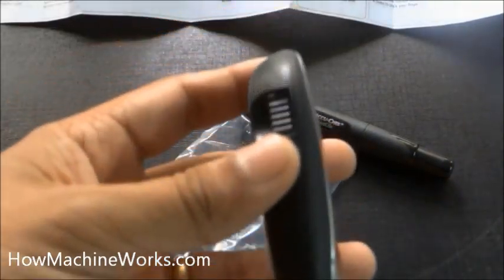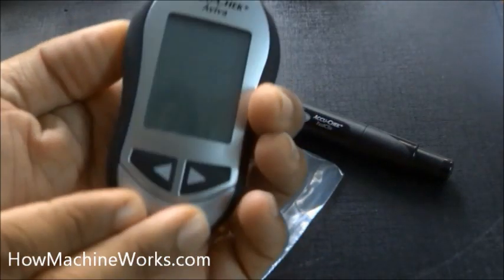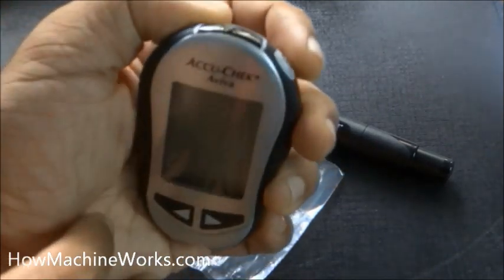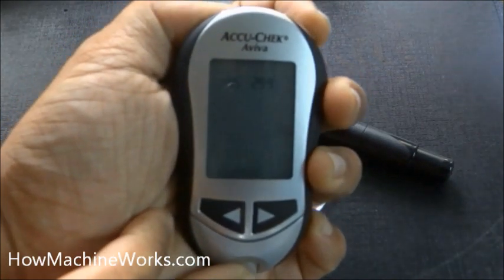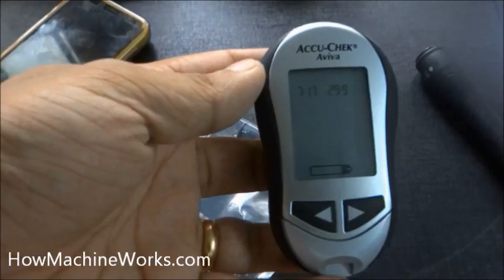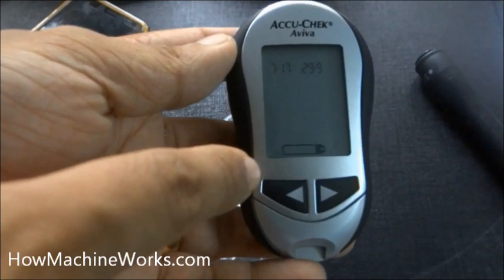Now that's the meter — the active check meter. The chip is already inserted. Now switch on the meter; on the top right corner we have the power switch. Just press it to start the active check meter. Now we need to set the time and date by clicking the arrow buttons at the bottom. Once the time is set, it shows a symbol indicating it is asking for the test strip.